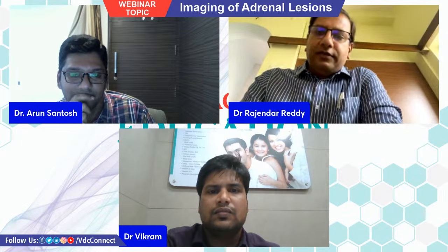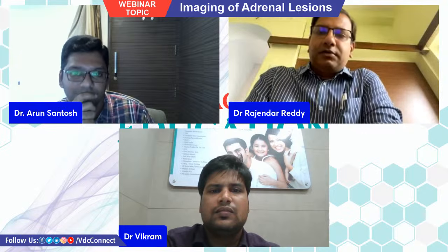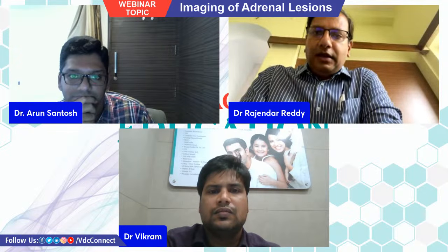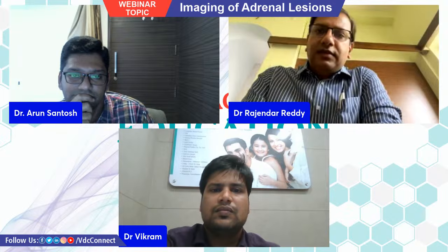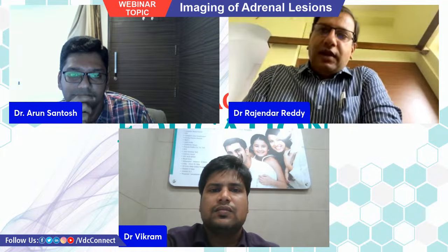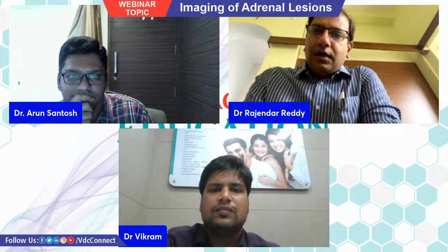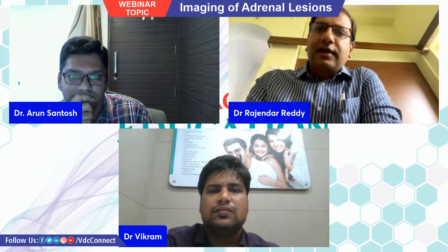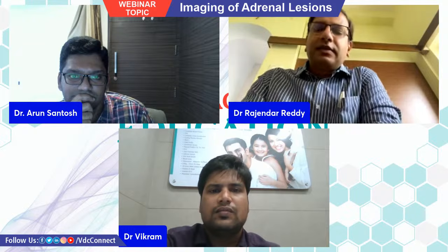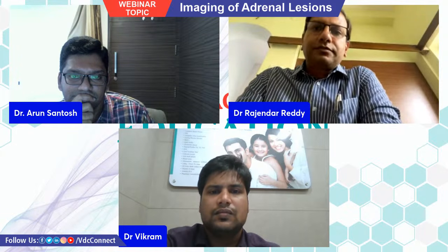Because if it is functional, there is no ambiguity in the treatment. We just go ahead with the surgery. If it is non-functional and the size or the Hounsfield criteria is suspicious but not suspicious enough to be obviously malignant, when it is in that gray area, then I think there would be a role for biopsy in that situation.